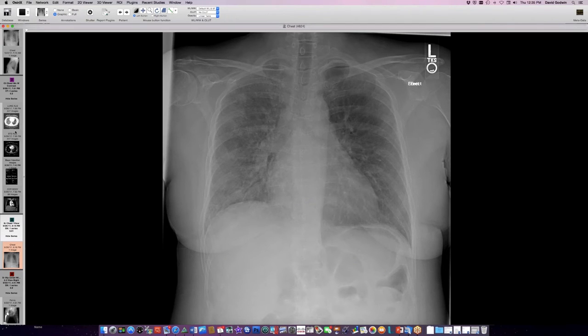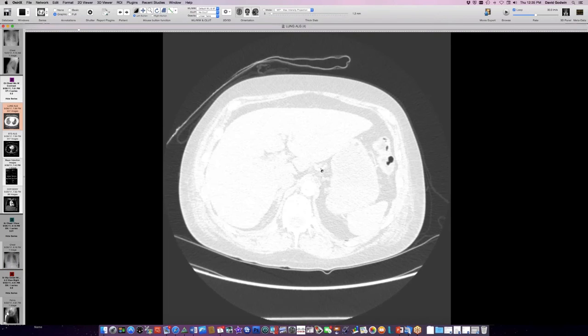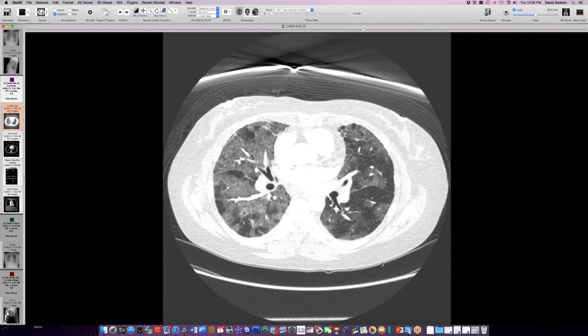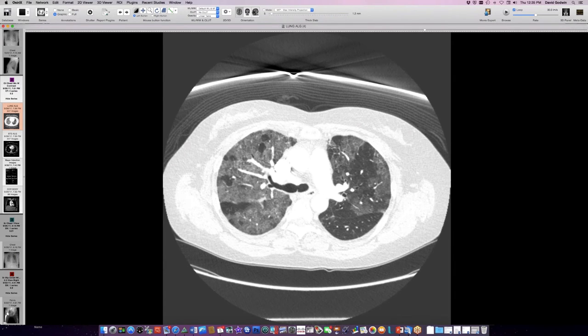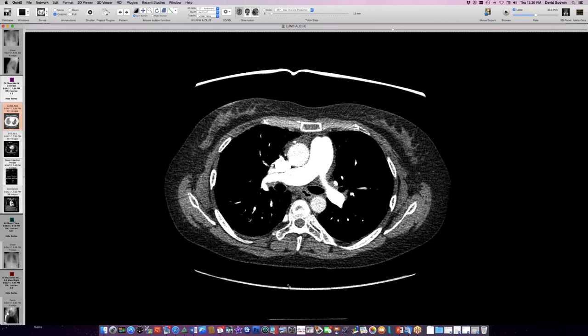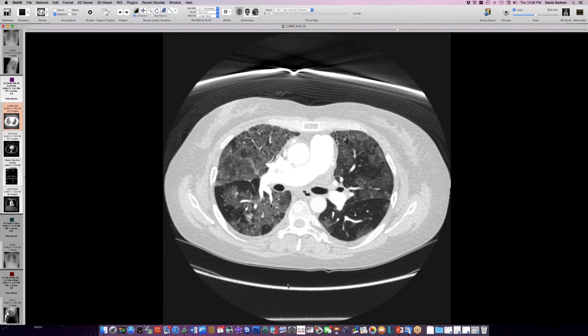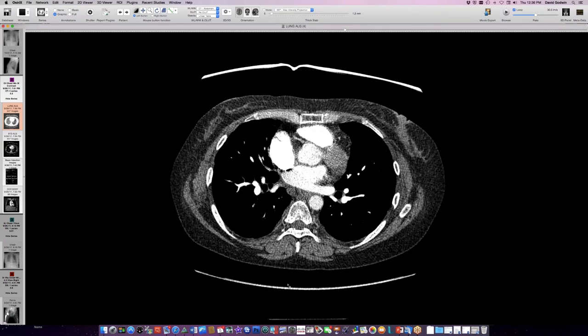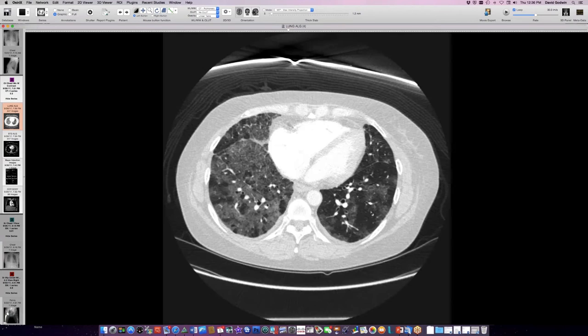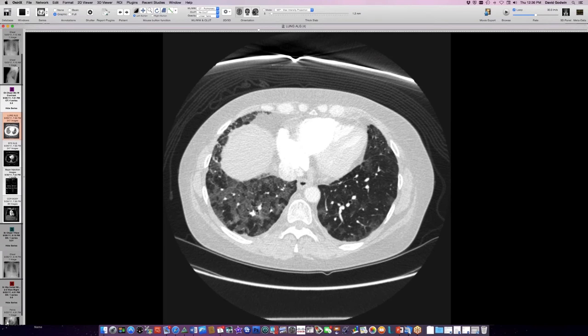She had a CT scan at this time, and it shows widespread ground glass abnormality with rather sharp demarcation against spared lobules. So this lobule is involved, and then a sharp boundary against a spared lobule, similarly spared lobules scattered around here, and some dilation of her pulmonary artery. On echocardiography she had modest pulmonary artery hypertension. She also had a dilated RV on echo, and I think we're seeing a little bit of that with some septal flattening or straightening. Her subsequent chest radiograph was even worse.